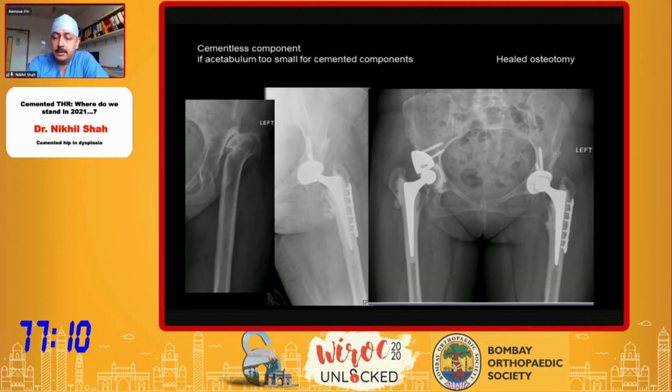In this case, the acetabulum was very small, and it was so small that I could not even get a 38 by 22 polyethylene cup inside. And so I use an uncemented cup for these cases. These are bantam cups, and they go as low as 38.